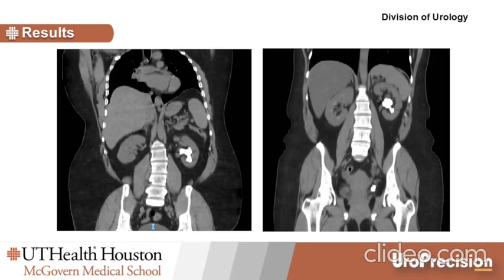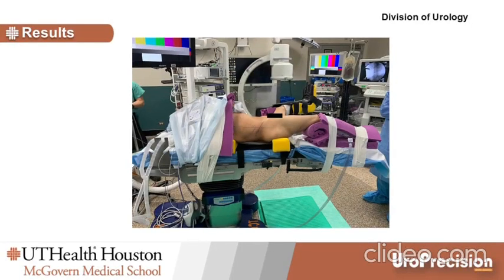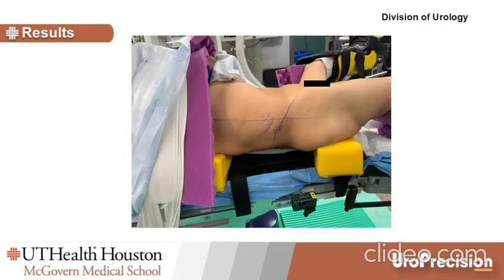To prepare for the endoscopic retrograde access technique, a thorough preoperative assessment, including a CT scan, is critical to select the optimal access window and identify the ideal calyx for puncture. We begin by positioning the patient in a Galdakao-modified supine position, which offers ideal access for combined endoscopic and percutaneous surgery. This position optimizes fluoroscopic and endoscopic access.